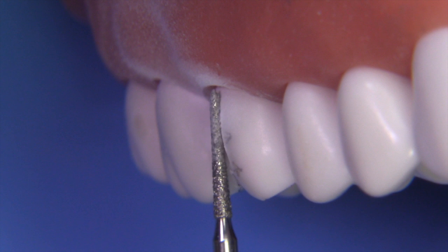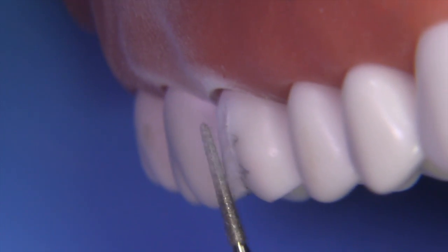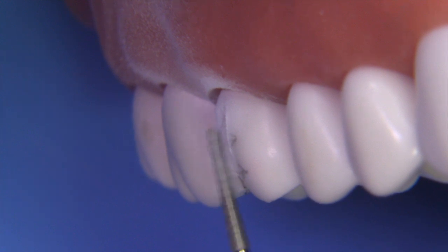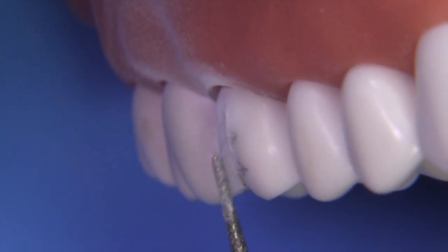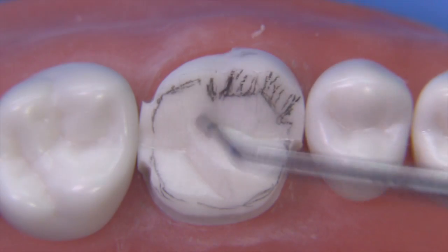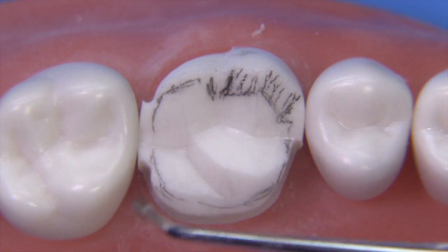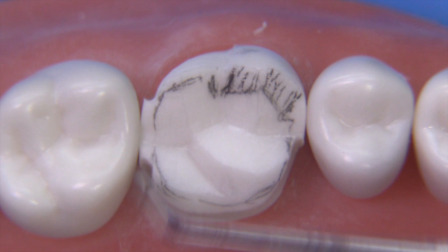Notice that you have two planes: the initial gingival plane, and then a tip plane to account for the contours of the teeth — the contour plane versus the retention plane down at the gingival. Use the adjacent teeth to get an idea of how you're angling things. At this point we've got the finish line location figured out; it's not quite deep enough axially, and we've gone as far as we can interproximally without hitting the adjacent tooth.